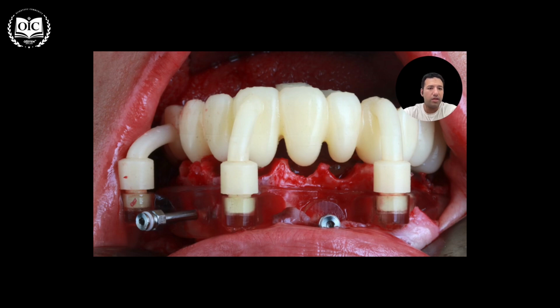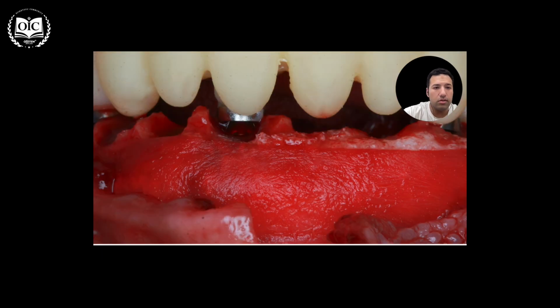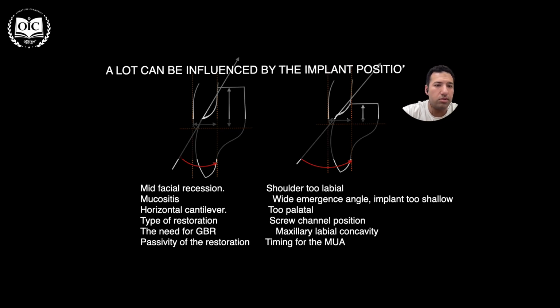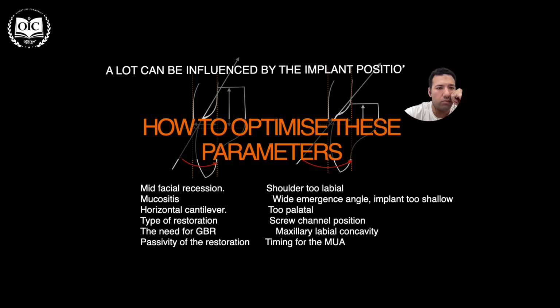We place our implants and try in our provisional restoration. Place soft membrane. This is a collagen membrane and a mixture of allograft and xenograft. Then pull everything up to support the tissue. Actually, this surgery was so recent, I didn't have follow-up afterwards.